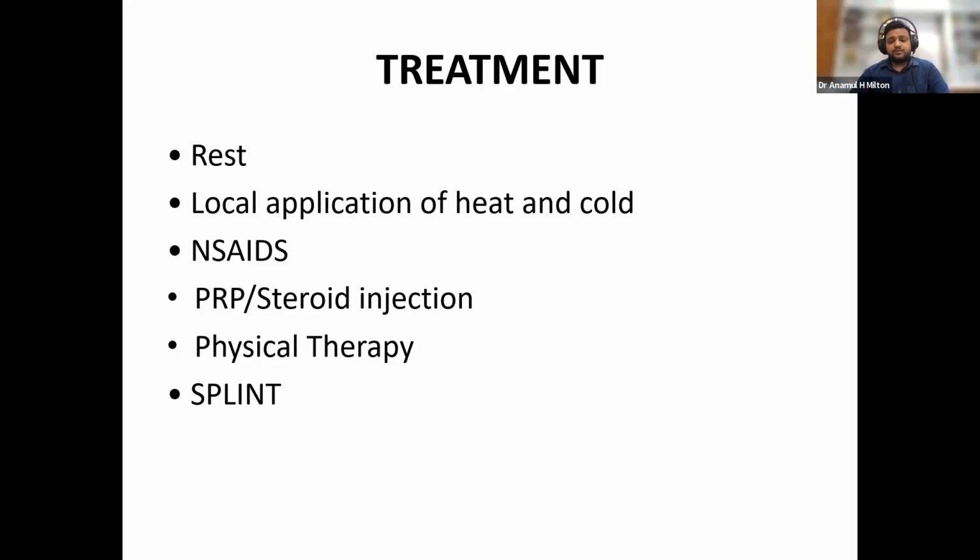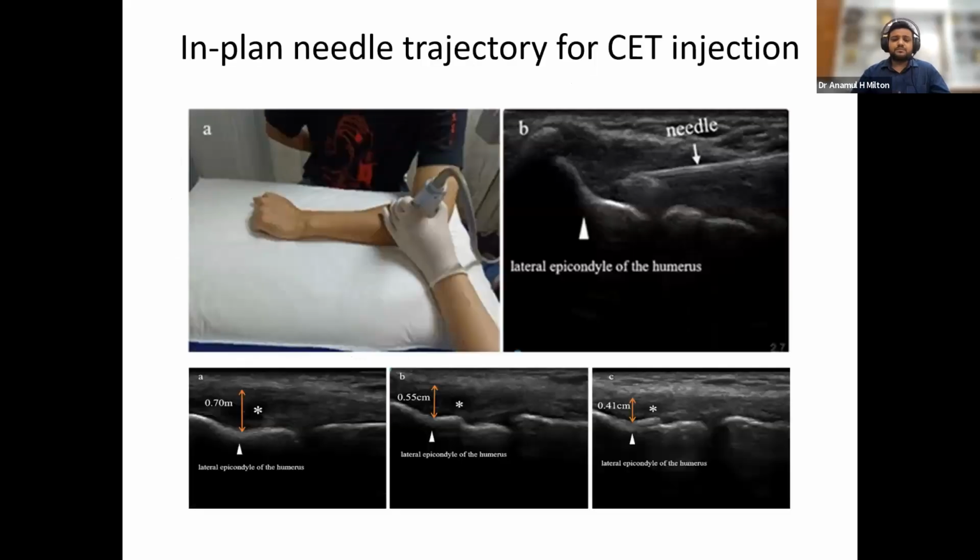If you are planning for steroid, you can inject below or above the tendon, not within the substance of the tendon. That is very important. You can also give physiotherapy, and sometimes a splint.